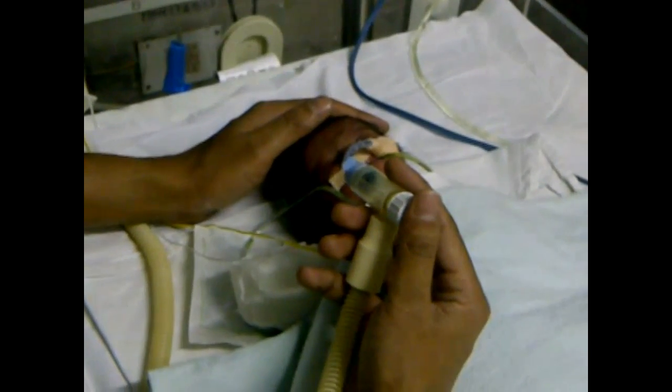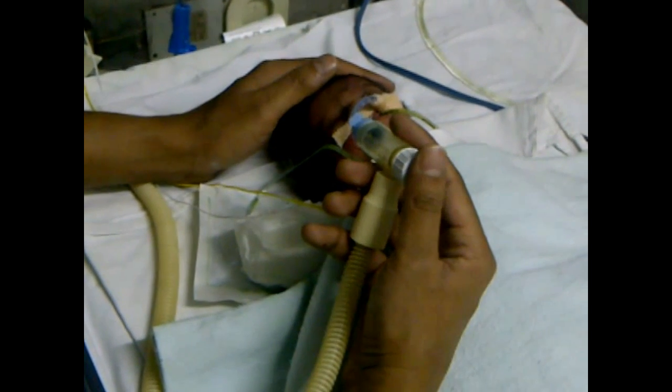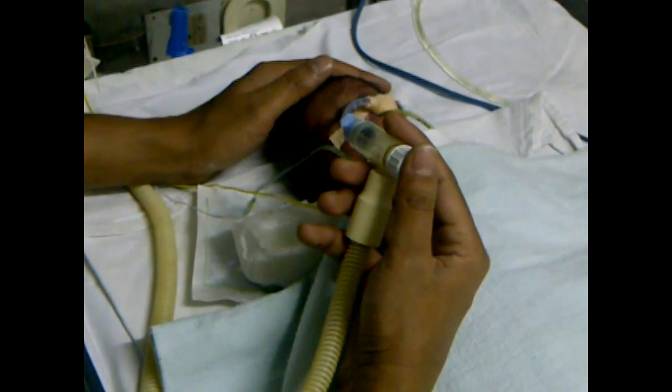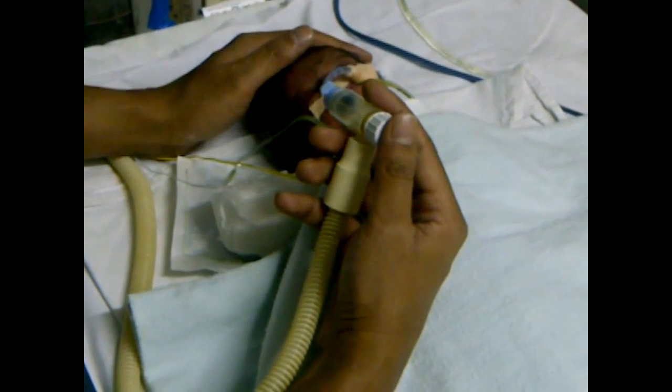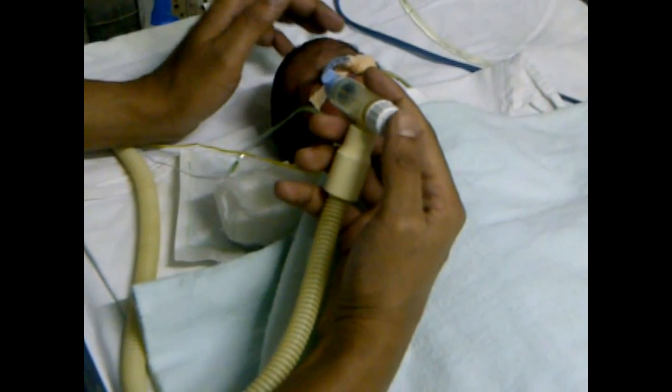Let us go to the patient's end. The corrugated tube arising from the gas outlet is attached to the T-piece. One head of the T-piece, as you can see, is attached to the endotracheal tube in this patient. We can also attach this to a mask. On the other end there is a white knob with central opening. This is called the PEEP valve.